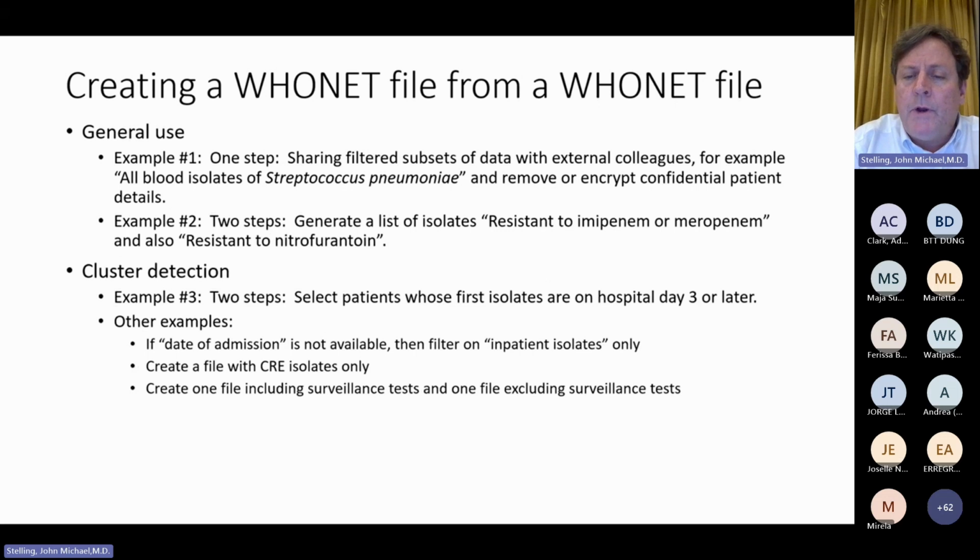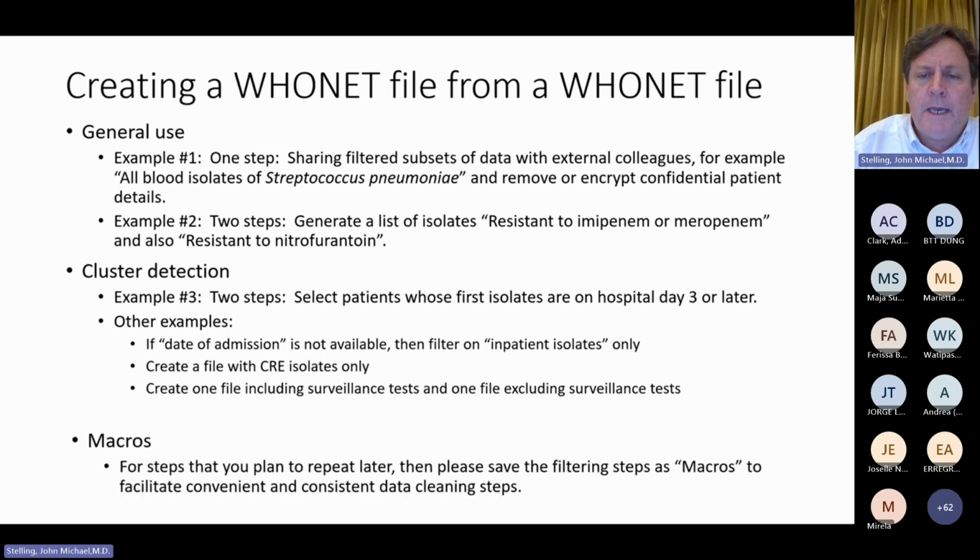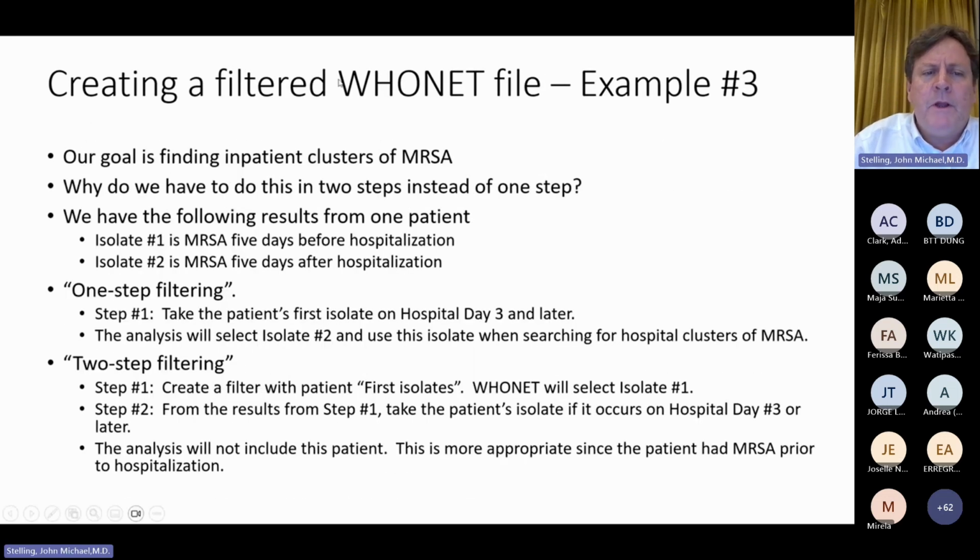Select patients whose first isolates are on hospital day 3 and later. Okay, this one's a bit more complicated because our goal is, for example, to find inpatient clusters of MRSA. Some people try to do this as one step. They say, please show me MRSA first on the inpatient unit. And they do this as one step, but they don't get what they think they're going to get.